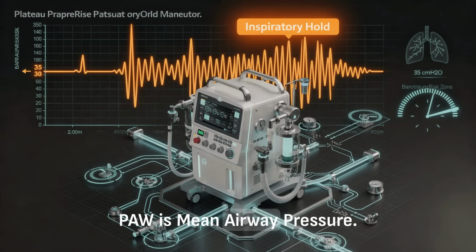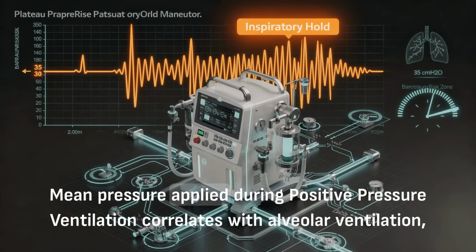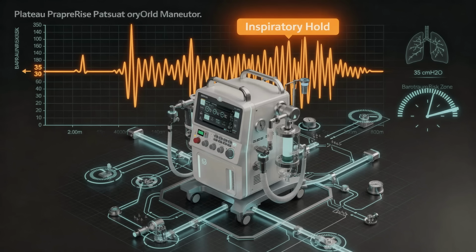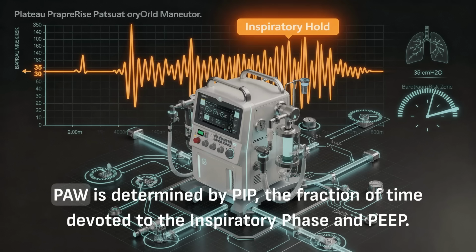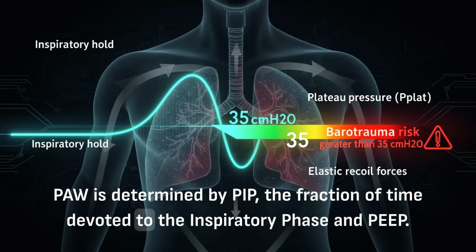PAW is mean airway pressure. Mean pressure applied during positive pressure ventilation correlates with alveolar ventilation, arterial oxygenation, and hemodynamic performance. PAW is determined by PIP, the fraction of time devoted to the inspiratory phase, and PEEP.